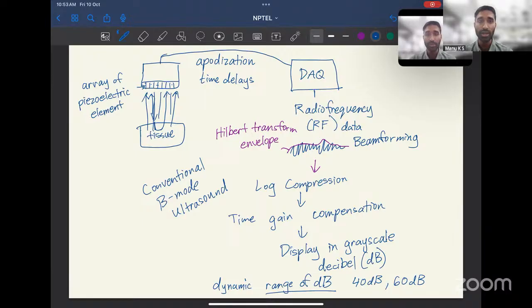So eventually, to answer your question, yes, everything is done on hardware, and multiple ways are there. And the most commonly used method is using these DSP cores, which are high performance ICs, which can do all these computational tasks in hardware. So basically, they are like ASIC kind of chips.